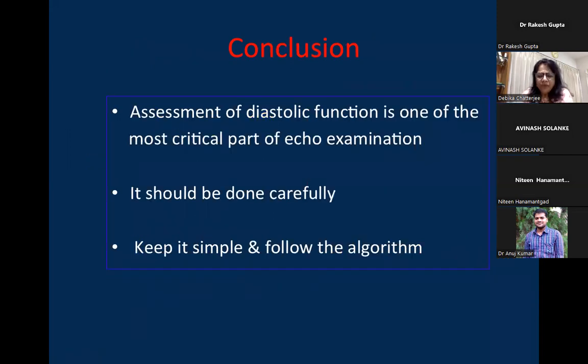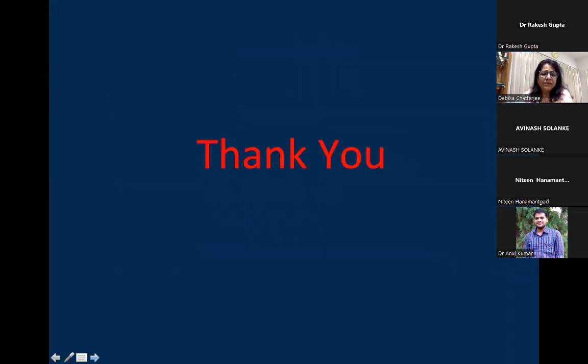So, my dear friends, to conclude, I would say that one of the most critical parts of the echocardiographic examination is the assessment of diastolic dysfunction, but you can do it if you do it carefully, keeping it simple, and follow the algorithm as I have said. Thank you.